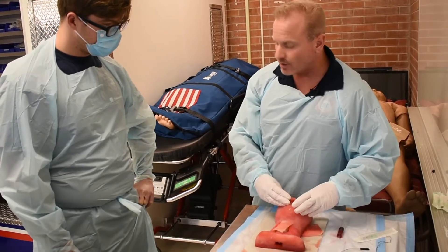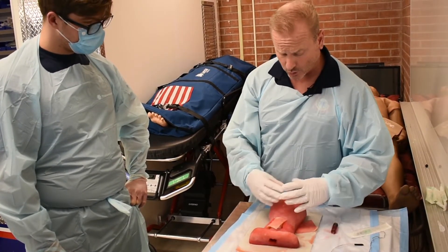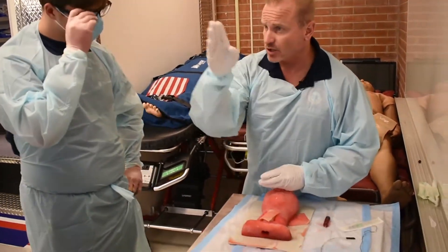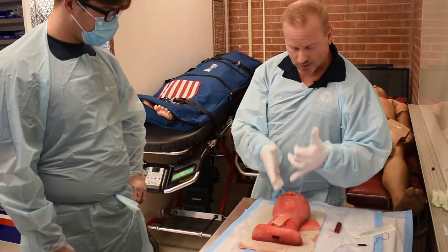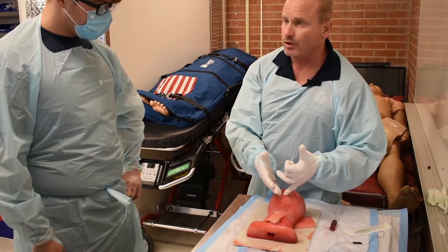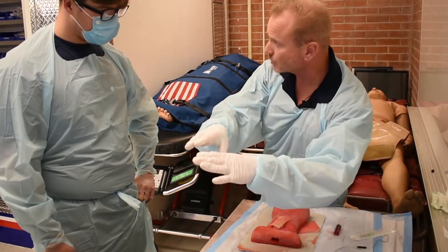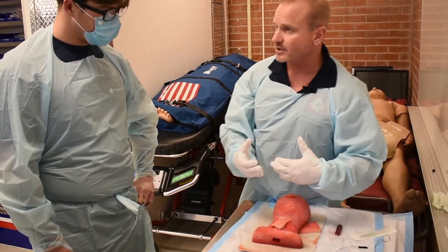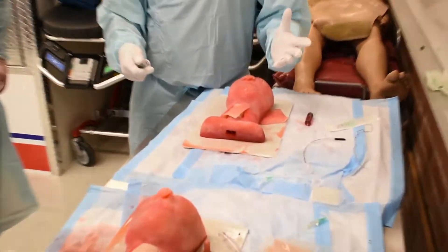In a difficult airway scenario — a 223 to the face, a real horrific burn to the face — I'm going to go into it thinking: set up for a crike. I'm going to set up for intubation, do my techniques, and when I can't do that, I'm going to look at you and say, 'Make it happen.' I'll drop what I'm doing except the BVM and move to support you. That's how you save lives. We joke it takes 10 minutes to crike — 9 minutes to talk about it and 1 minute to do it.